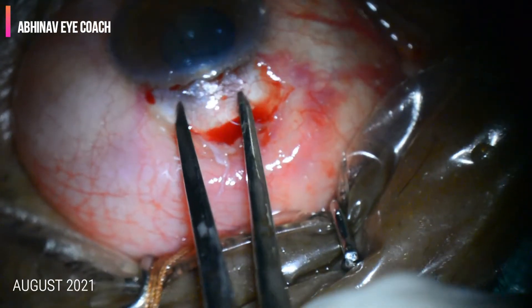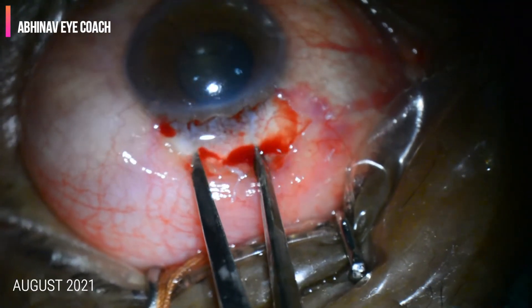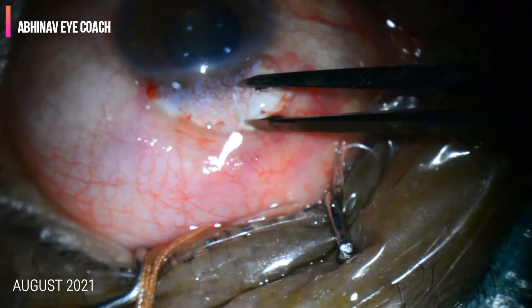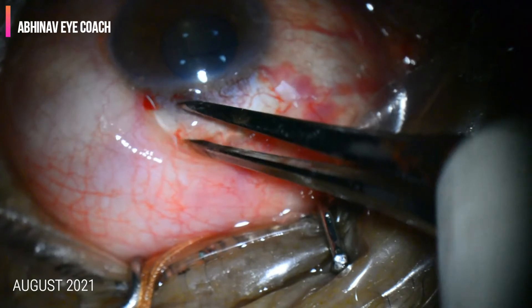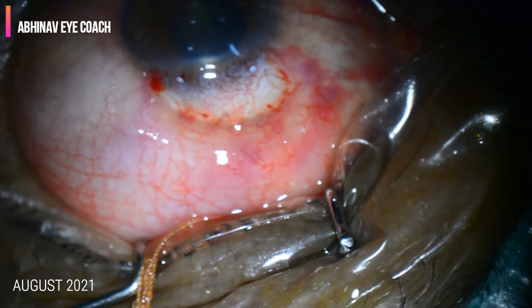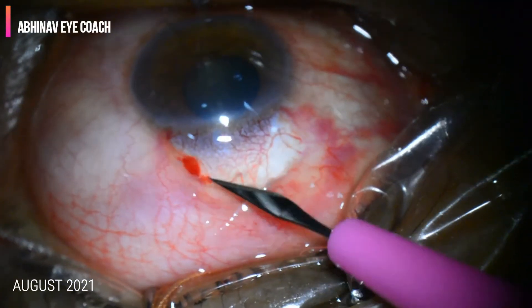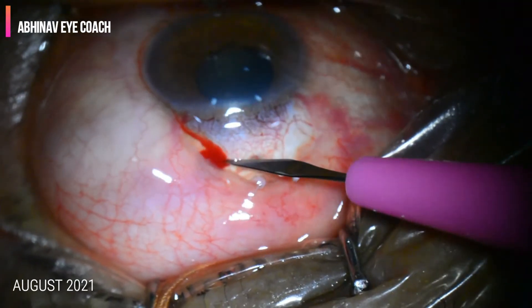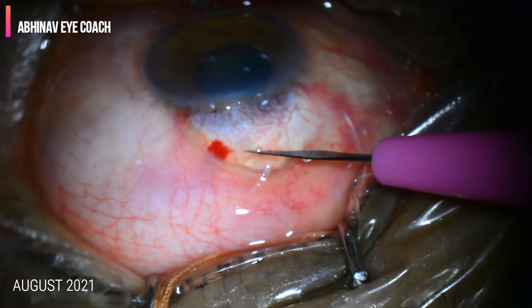To start making the scleral flap, we first measure the area where we are going to make it. The height of the flap should be 3.5 mm — 3.5 x 3.5 on both sides — and the roof should be around 4 mm. So the length and width should be around 3.5 x 4 or 4 x 5 mm. I usually make a rectangular flap.